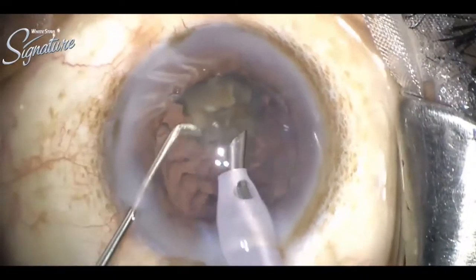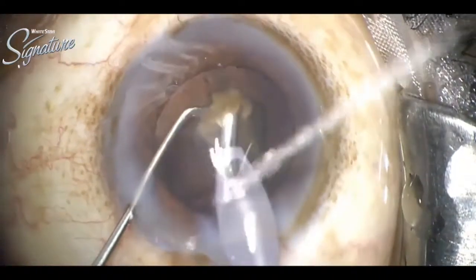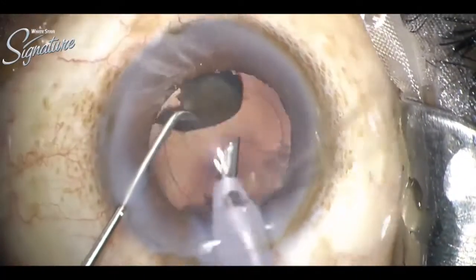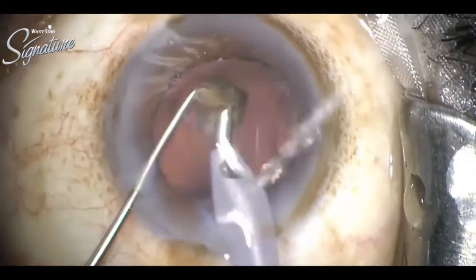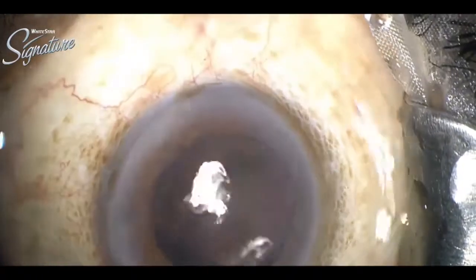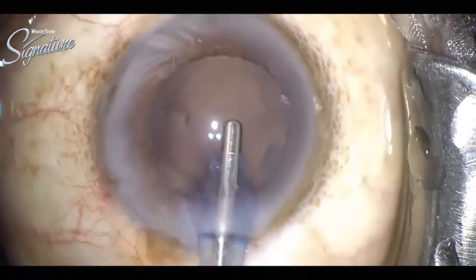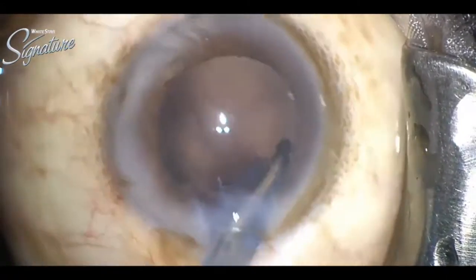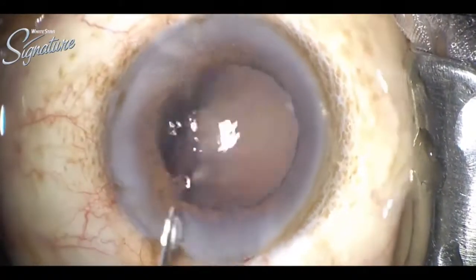For the last piece, the chamber is again filled with viscoelastic, and saline is given in the wounds to decrease the heat generated. Very few cortical remnants and fibers are there, which are clear.